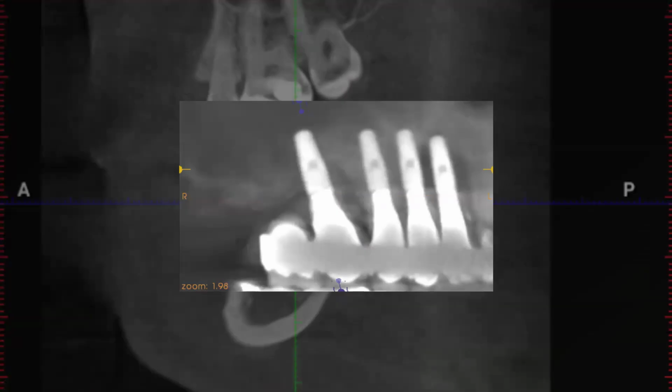This was another case I was involved in. Not great quality, but these are maxillary implants. And the bone of the sinus goes about like this. They planned these implants just based on panoramic imaging. And they misinterpreted the depth of bone because this patient had so much fluid in the sinuses. They had some sclerosis. This patient had a long history of sinusitis.